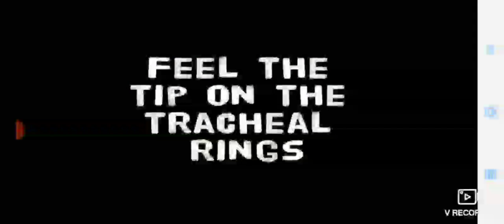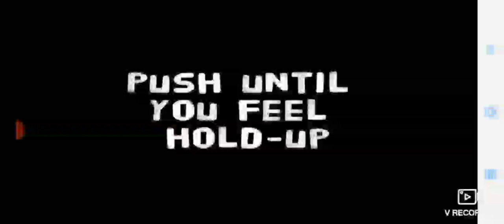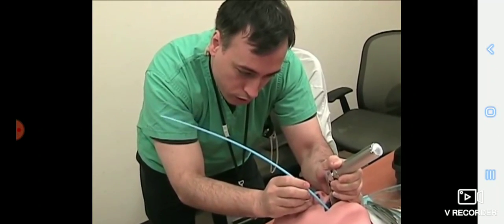The first one is you could actually feel the tracheal rings. You'll feel the tip of that bougie, that coude tip, rubbing against the tracheal rings. For me, sometimes I feel it, sometimes I don't. What I keep doing is I keep pushing the bougie forward very gently, and eventually, if you're in the tracheobronchial tree, you'll get a holdup. Either you'll hit the carina or one of the branches of the main stem bronchi, and the bougie won't go any further. It'll stop at about 40 centimeters.